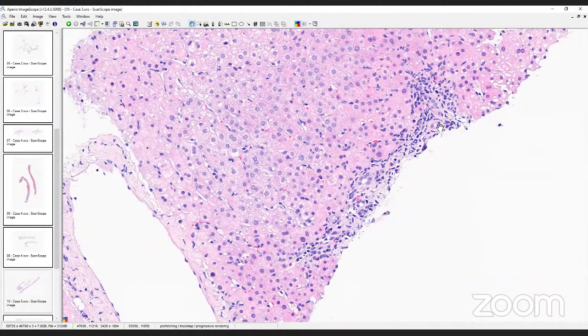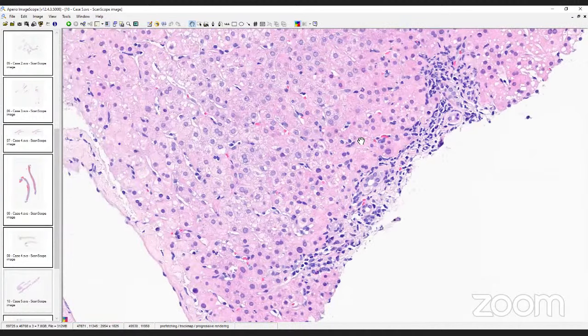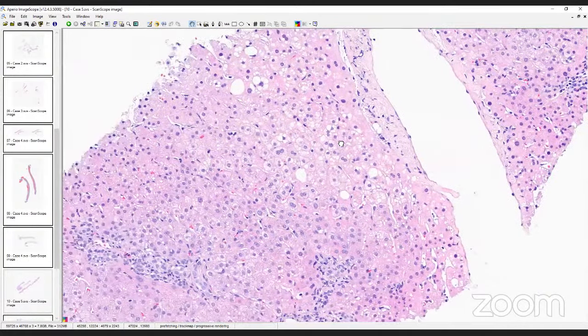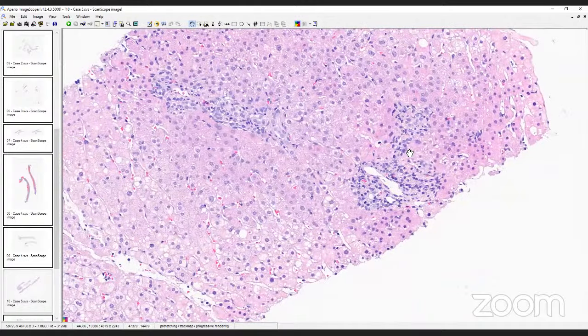The next portal tract, look at this bile duct. It's left with like three measly nuclei. So it's really attenuated, as is this one. There are cells here that are disappearing. And if we did a CK7 stain on this, this would show a little bit of ductular reaction as well as inflammation. So there's ductular reaction, inflammation, and very sad looking bile ducts. Same story with this portal tract. Here's your bile duct that's damaged.